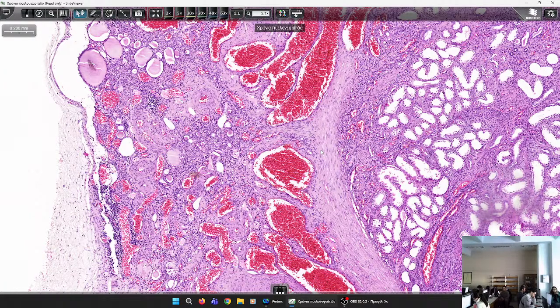Yeah, fibrous tissue. Remember, I showed you the disfigured gross image from the kidney. This is the tissue that caused the disfiguration. The scar tissue, which is a consequence of chronic persistence of inflammatory cells. So, we have this coarse scarring tissue.